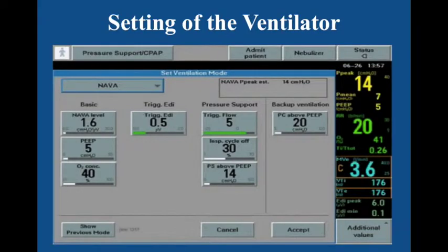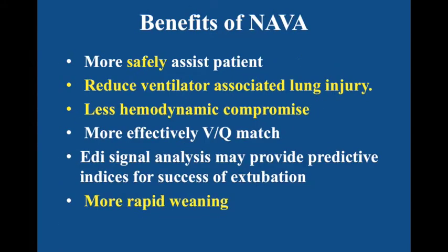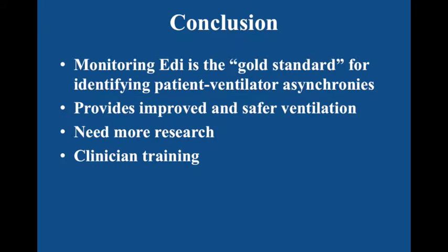Okay, let me make a conclusion. The most important thing for NAVA is monitoring. Indeed, Edi is the gold standard for identifying patient-ventilator asynchrony. Trigger is the most important part. And NAVA provides improved and safer ventilation.